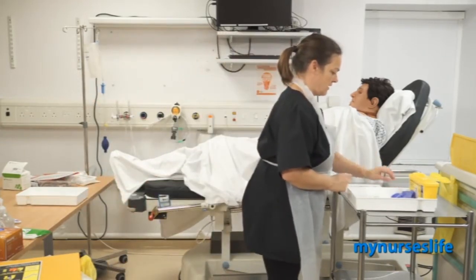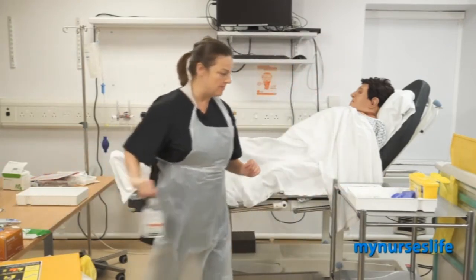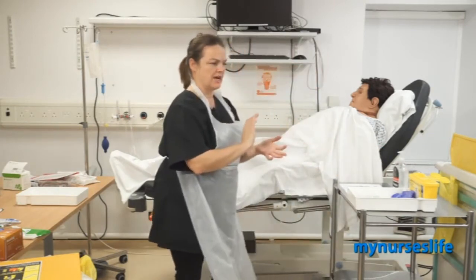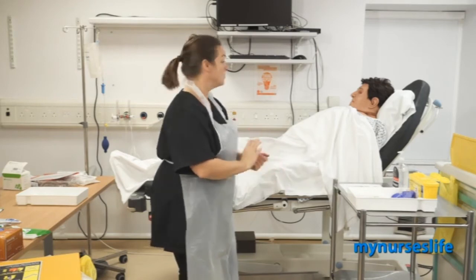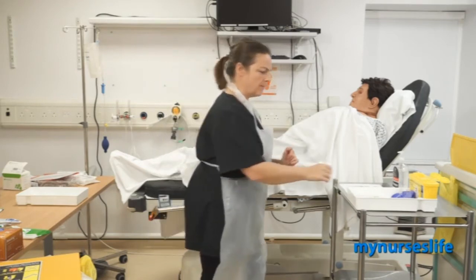Okay. So, is it okay if I just have a look at the area where I'm going to inject? Can you remember where they injected last time, Emma? Whereabouts did you get the injection last time? Was it your stomach or leg? Oh, it's on your right thigh. Okay. So is it okay to look at your left thigh? Would that be all right?